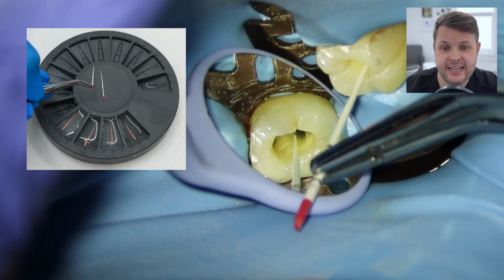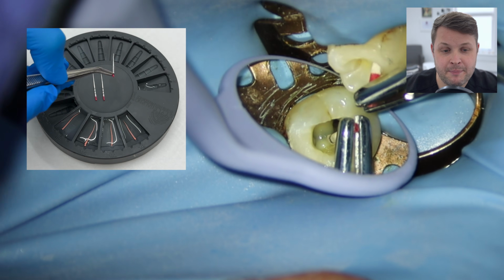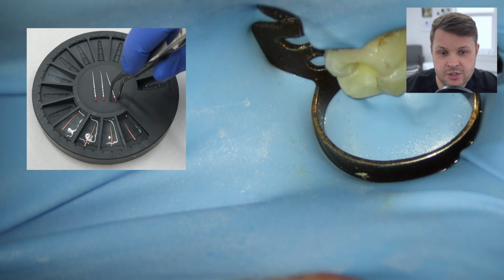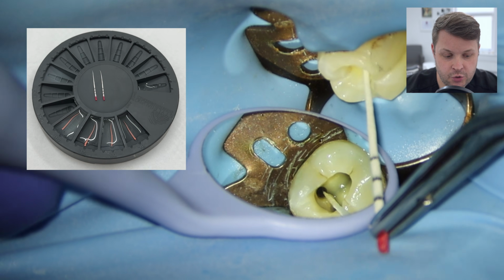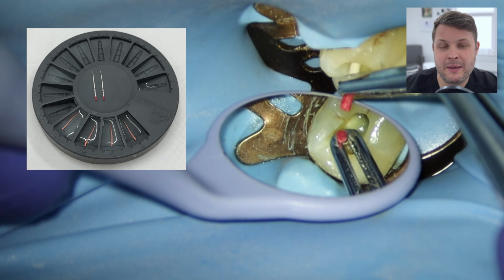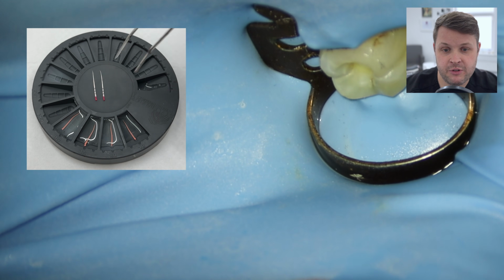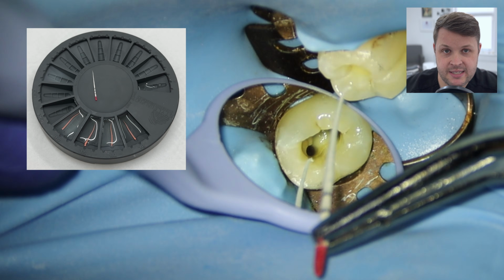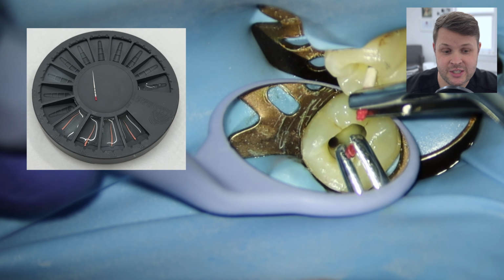And then, as you can see here, my nurse is just placing more and more paper points until I say to her, I'm getting to the end now, I don't need any more. And this is great because obviously you're not physically going into the bit where the paper points are. So from a disinfection point of view, it's a separate area that the nurse knows she can place things down there, and then obviously she's clean and I'm dirty, shall we say.